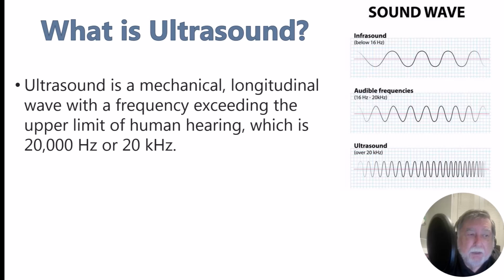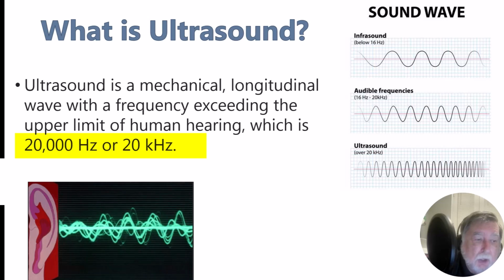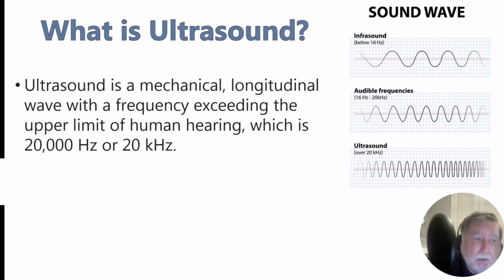Ultrasound is a mechanical longitudinal wave with a frequency exceeding the upper limit of hearing, which is 20,000 hertz or 20 kilohertz.